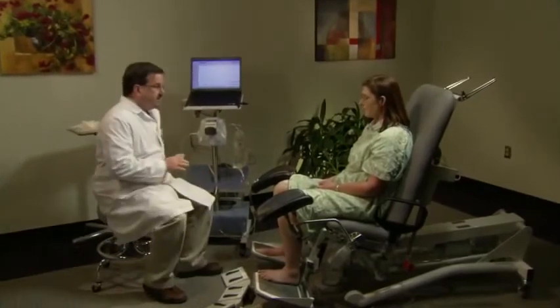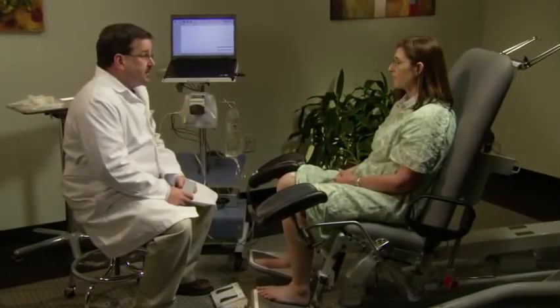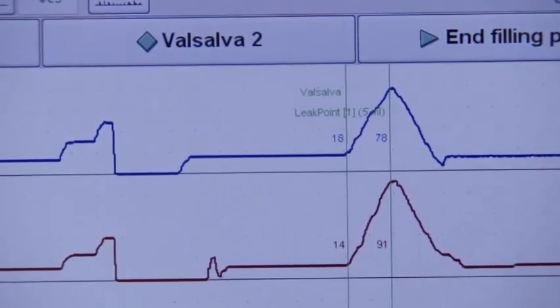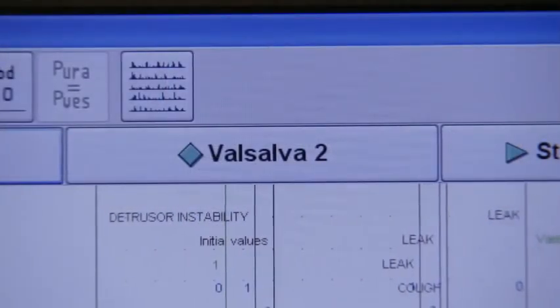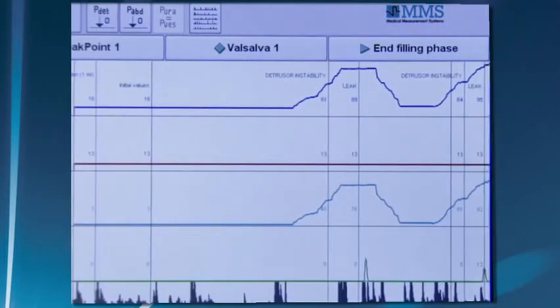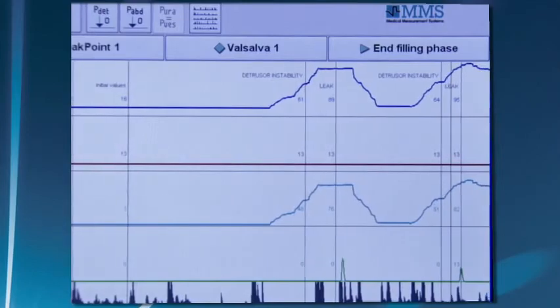As the bladder fills, the technician asks the patient to verbalize when her sensations increase, and evaluates for stress incontinence by performing Valsalva maneuvers and coughs at set intervals. To perform a Valsalva, press the Valsalva button and have the patient slowly bear down, tightening her abdominal muscles. If a leak occurs, use the leak point button to label it. Urge incontinence or detrusor instability is exhibited by a contraction of P-vesicle and P-detrusor pressures with little or no change in P-abdominal pressure. Leakage is recorded by the flow meter if the patient is positioned on a Sonesta or commode chair.